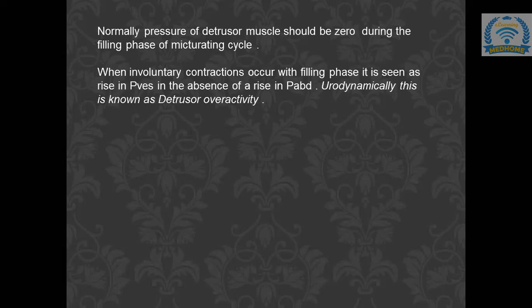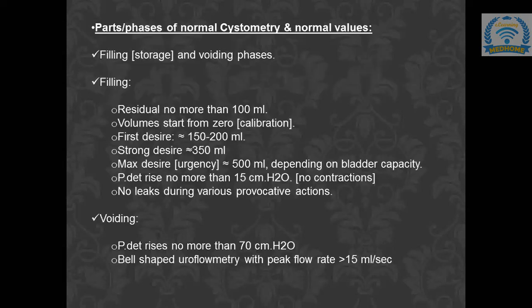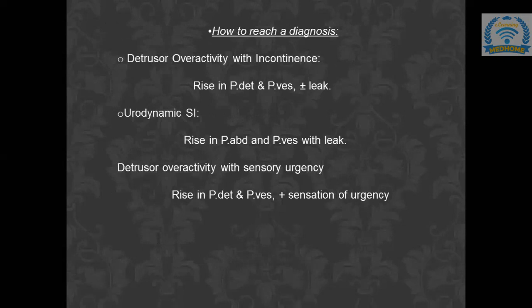And what is going to be the shape of the curve? The shape of the curve should be bell, and flow rate is more than 15 ml per second. Excellent.